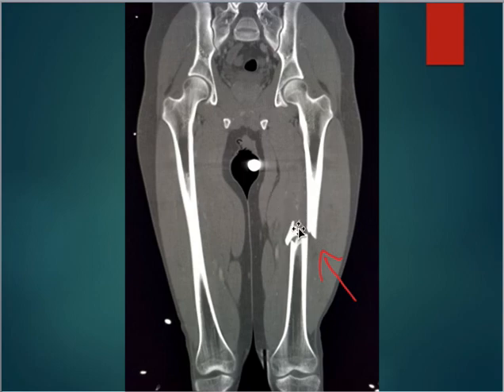This patient has a broken femur. You can see here, and you can see the nice little piece that's separated from it.